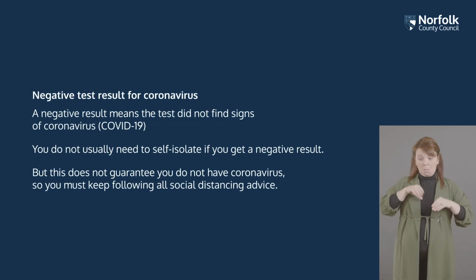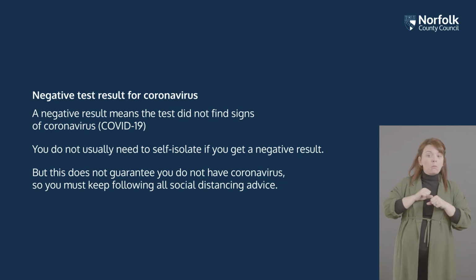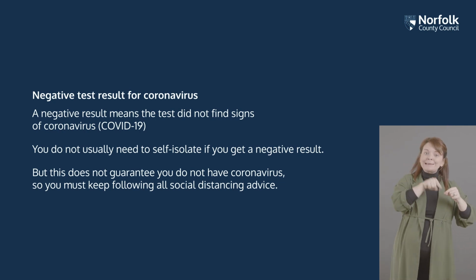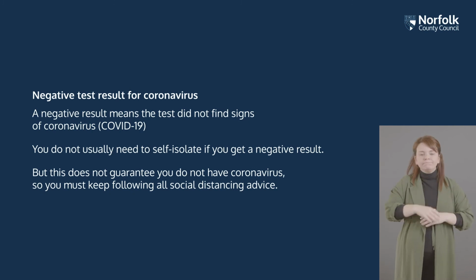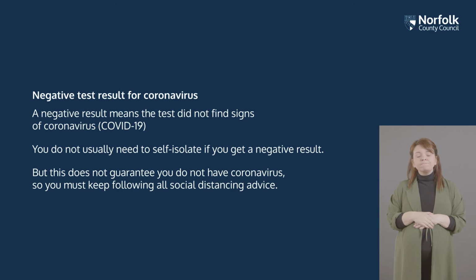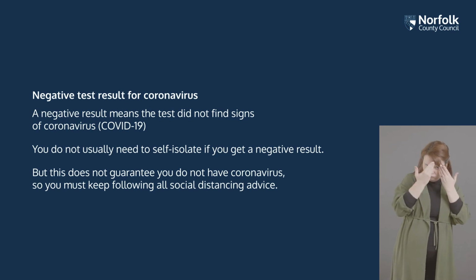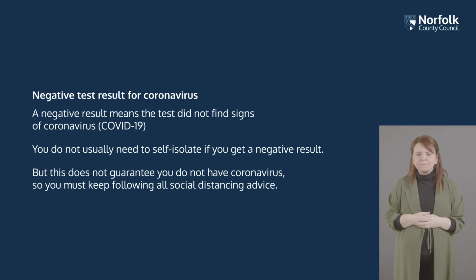Negative test result for coronavirus. A negative result means the test did not find signs of coronavirus, COVID-19. You do not usually need to self-isolate if you get a negative result, but this does not guarantee you do not have coronavirus, so you must keep following all social distancing advice.